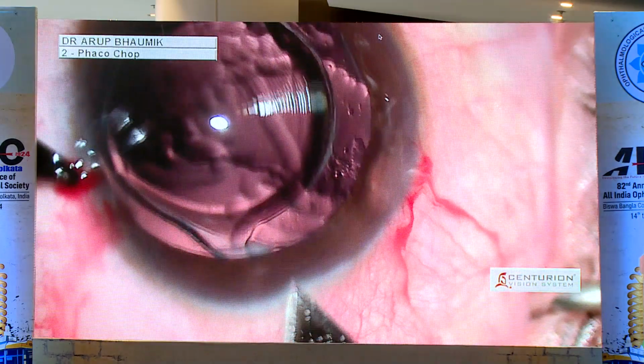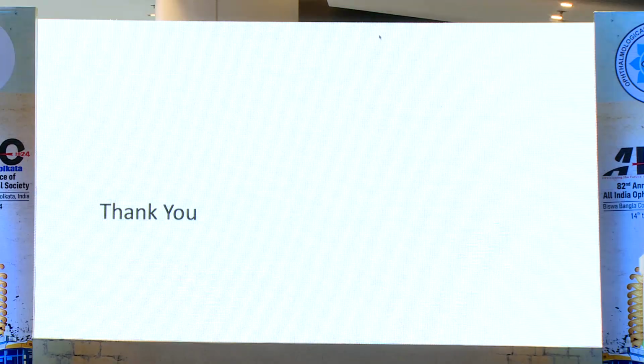So thank you so much for the kind attention. I always advise you to stick to one type of cutter. There are a lot of cutters available in the market, but frankly speaking, Indian companies are not good, because of the hinge or the quality of steel, that cutter is not good. And if you buy one Rumex or the Rumex modified one that is made in Ukraine, it will last at least 5 to 7 years. So go and invest. It is worth investing in the cutter.